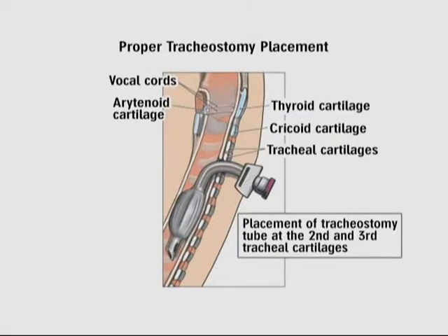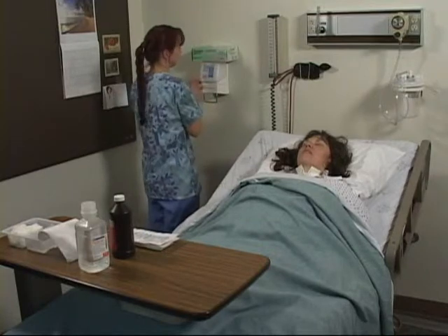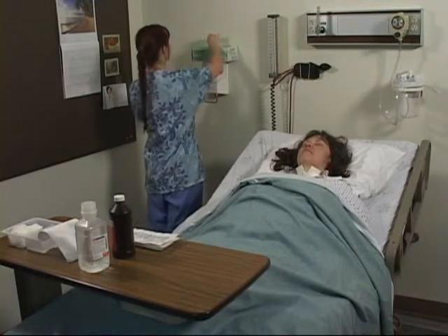A client with a tracheostomy has secretions that collect through the tracheostomy tube and require suctioning. These secretions can also cough around the tube such that the skin and tube require special care. Because the tracheostomy tube is holding open the airway, special care must be taken that the tube is not dislodged during the cleaning process. As before any procedure, wash your hands and wear gloves.